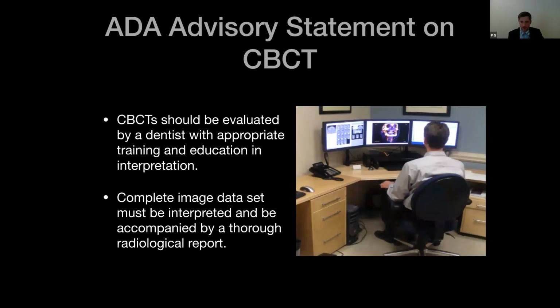And above all else, you know, document. Write down what you see. And really that's the big question that I'm asked a lot: do we need to look at everything in the scan? And we'll go over some other common questions that I've received over the years as well. But again, this was put out by the ADA in 2012, and it's a pretty quick read.